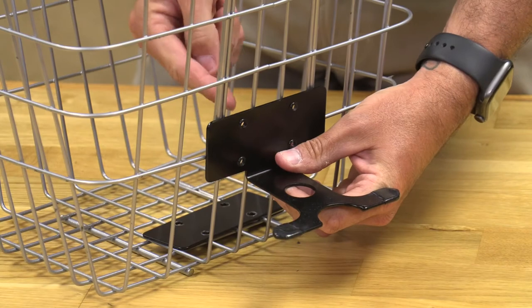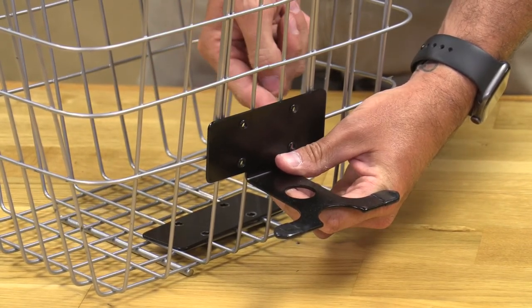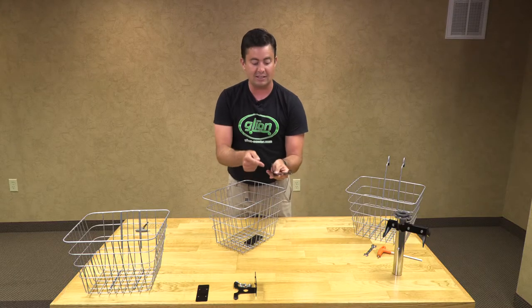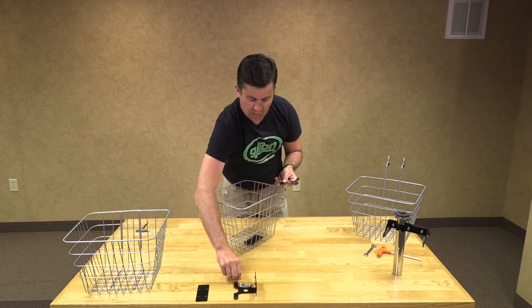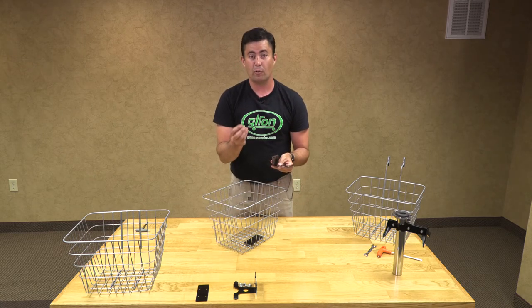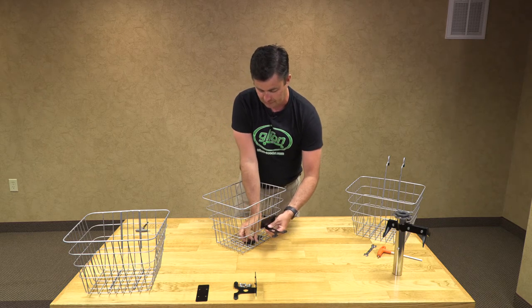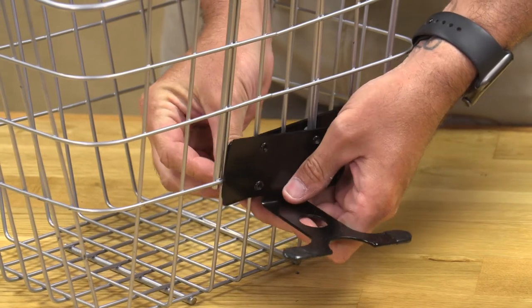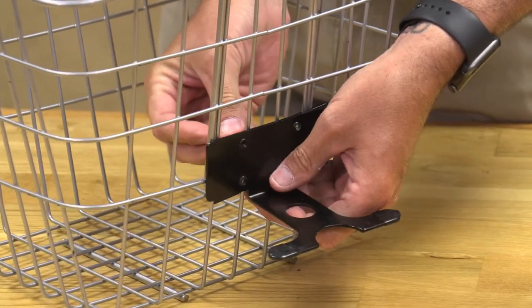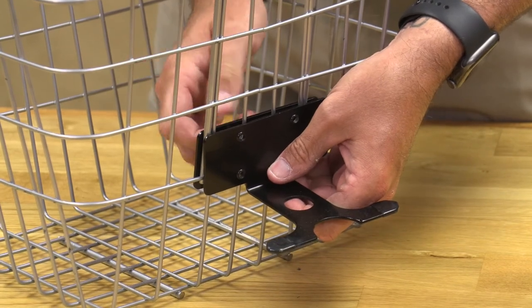The bracket goes between this brace right here, so that there are four bolt holes — one goes above it, one goes below it, and on the other side one goes above it and one goes below it. This bracket does have threaded holes, so there are no nuts that we will be attaching. Our bolts are 4mm Allen wrench bolts.